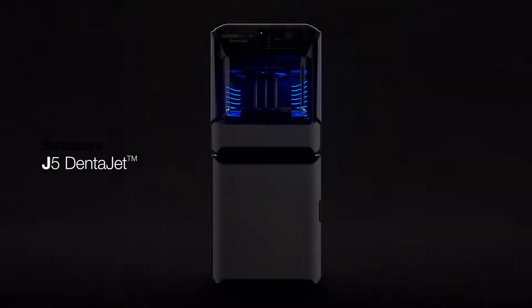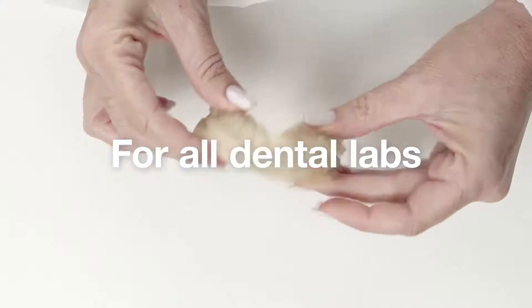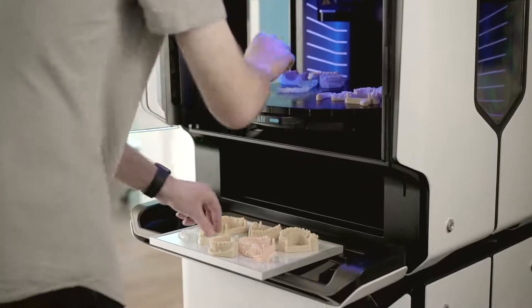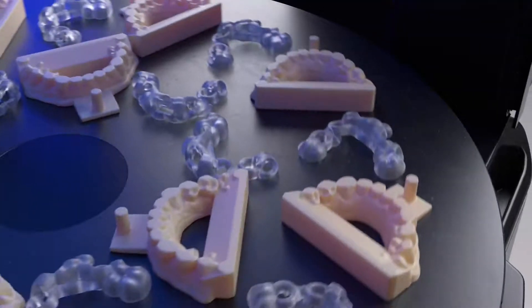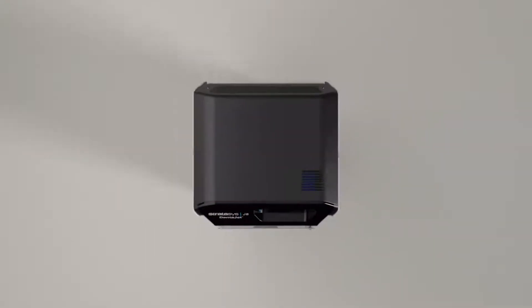Introducing the Stratasys J5 Dentajet, the all-around compact 3D powerhouse for all dental labs. Simplify your production and maximize throughput with precise, unattended mixed tray printing. Our 360-degree rotating build tray allows you to print in multiple materials at the same time, giving you maximum output in the smallest of footprints.